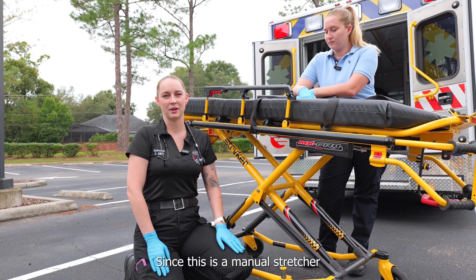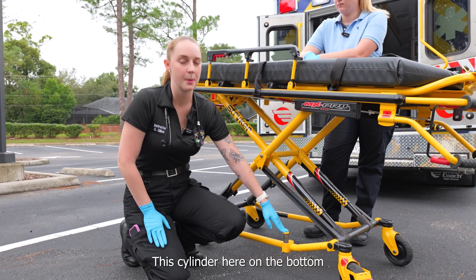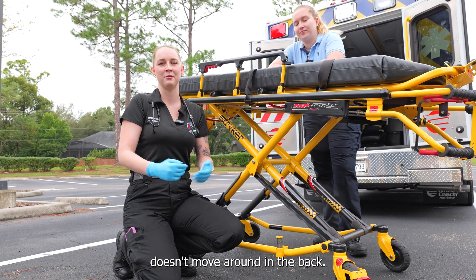Since this is a manual stretcher and not an electric stretcher, it has to get locked in place manually. This cylinder here on the bottom goes into the hook that's inside the ambulance and helps secure it in place so that the stretcher doesn't move around in the back.